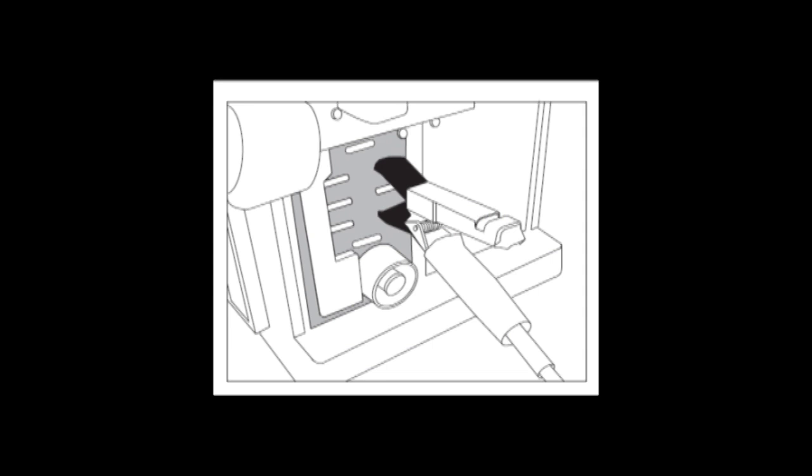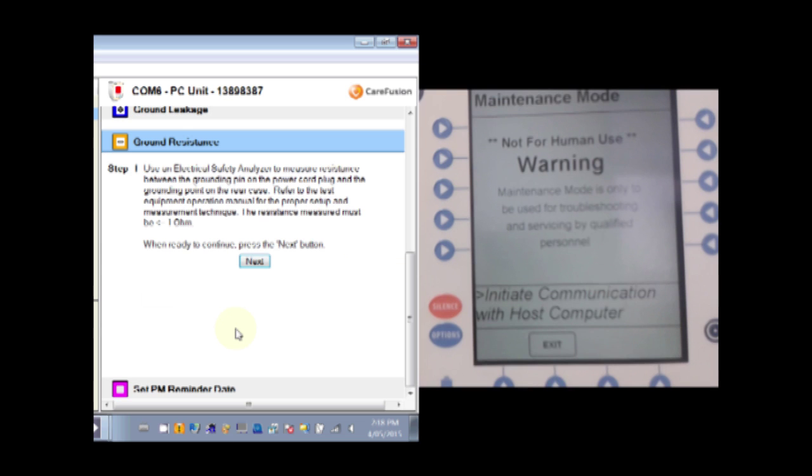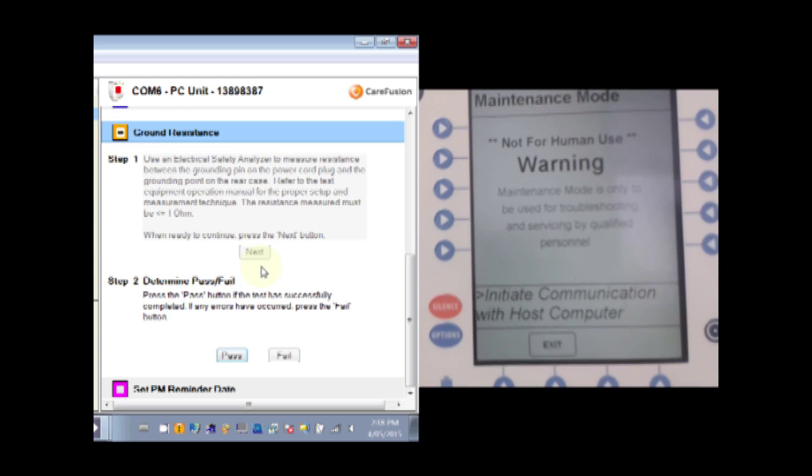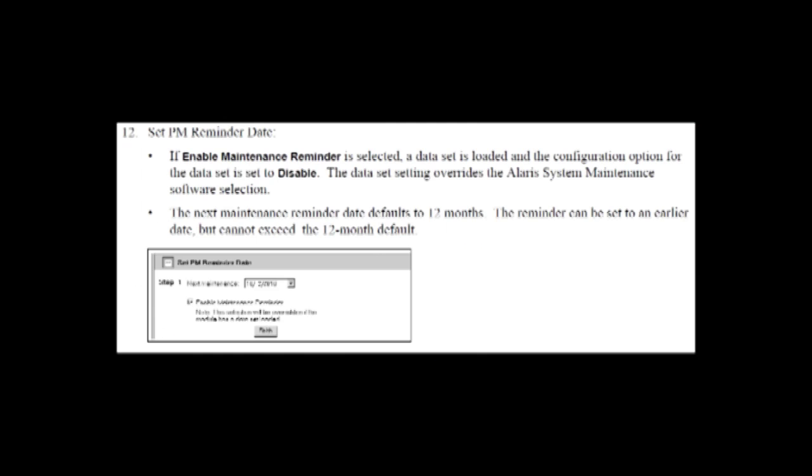As with the earth resistance you need to connect at the back and scrape into that aluminium plate to get a good ground. And we now set the all important PM reminder date for 12 months. This may or may not be enabled in your pump though.